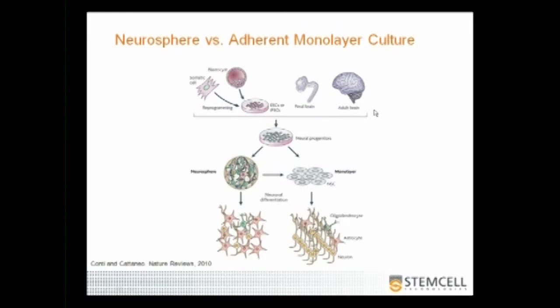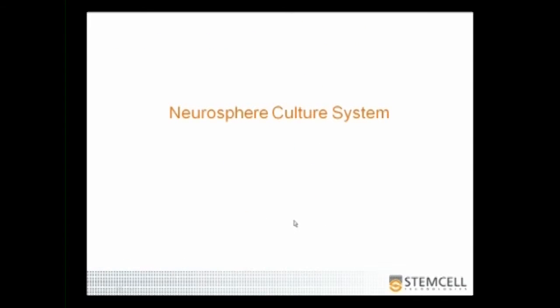As I mentioned previously, neural stem cells can be obtained from all stages of the developing embryo, from the most primitive developing neuroectoderm, the fetal brain, until the adult brain stage. Neuroprogenitors, which include stem cells, can then be studied using the Neurosphere culture or the Adherent Monolayer system. While the Neurosphere culture system has been most widely and extensively used for over 15 years, it's only recently that the culture conditions for the Adherent Monolayer system have been optimized to produce long-term adherent cultures from mouse and human cells. In both systems, a population of cells which have the ability to self-renew and demonstrate multi-lineage potential has been isolated. I will first describe the Neurosphere culture system.